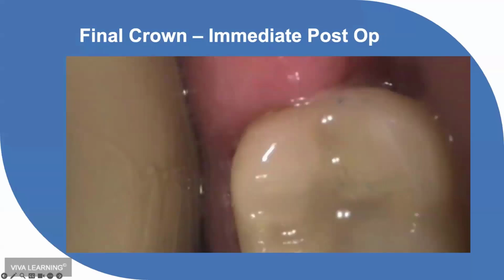Couple quick questions here coming in. Do you wind up with any dry sockets? So again, by the way, this is an example of closed technique for crown lengthening where I'm not creating any new pockets. I'm lowering the level of bone to account for biologic width, at least 2 millimeters below the margin. Very simple, very straightforward. Do you wind up with any dry sockets after using the laser?